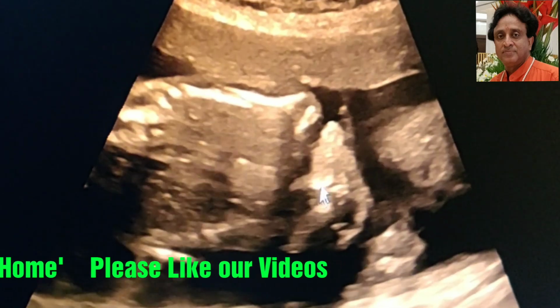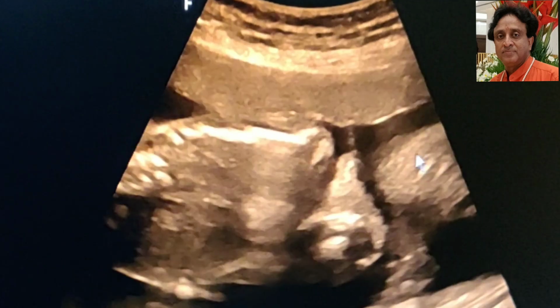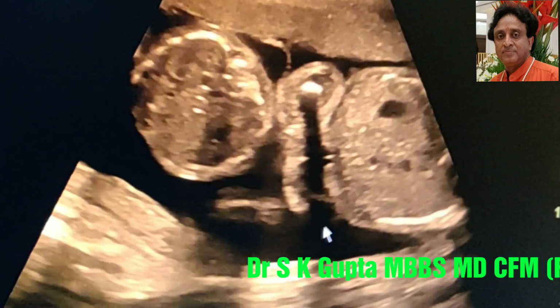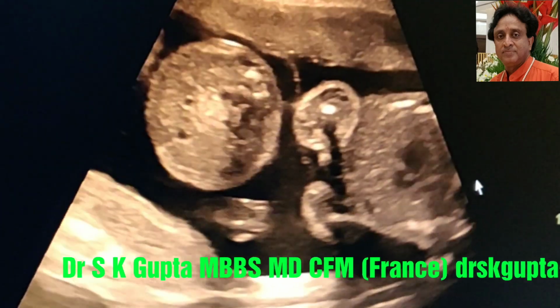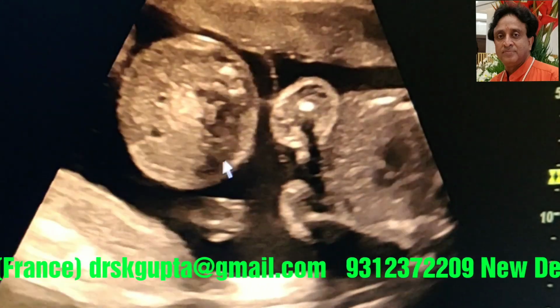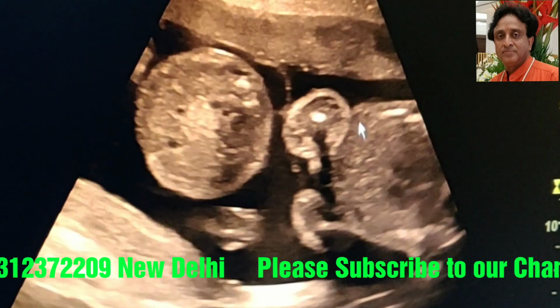This is another section in which the brain tissue can be seen hanging, and this is the anencephalic fetus. This is the normal fetal part of the other fetus. This is for the comparison. Both the hearts can be seen in one view, and this is a slightly smaller fetus, growth retarded fetus, and this is a larger fetus which is the normal fetus.